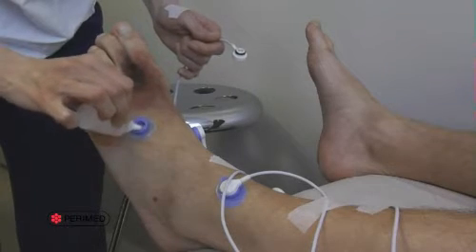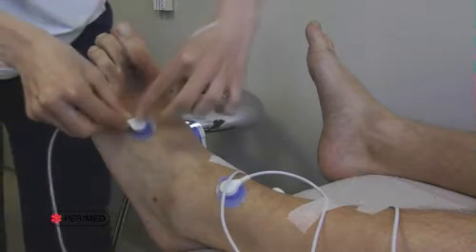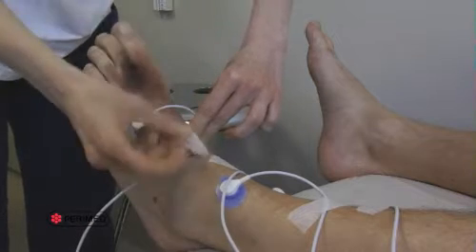Now let's discuss using TCPO2 to assess wound healing potential. On the foot, while breathing normobaric air, that is air at ambient atmospheric pressures, the average TCPO2 in a healthy person is always greater than 50 millimeters of mercury.